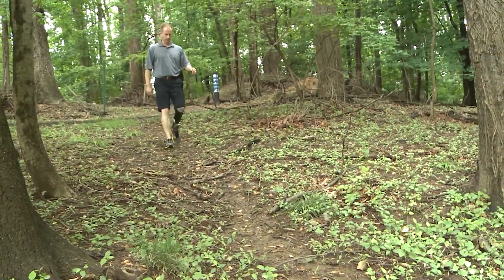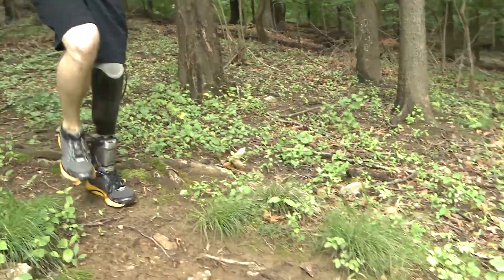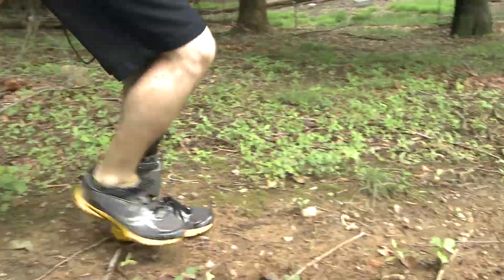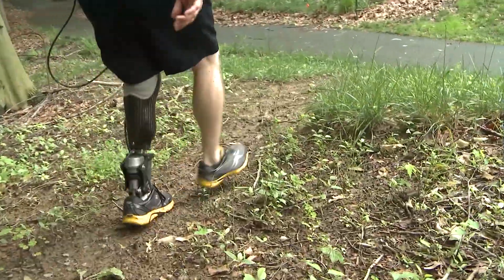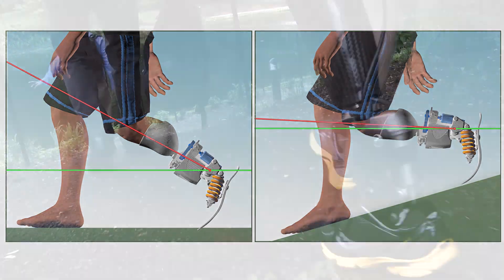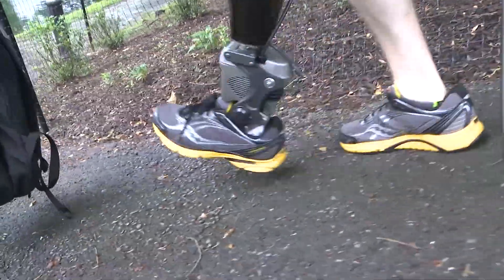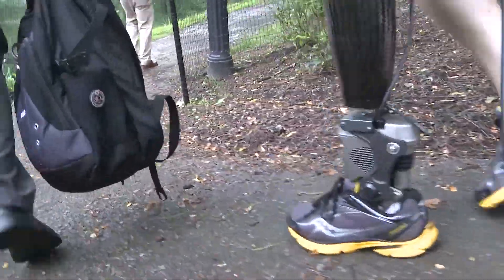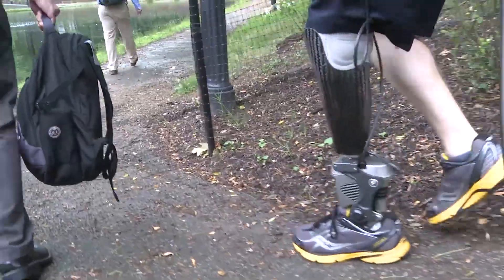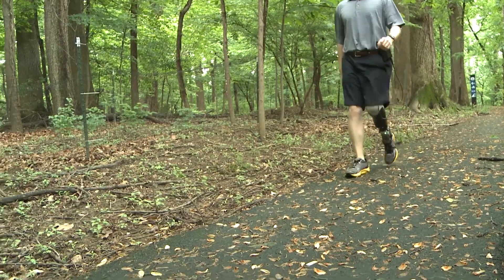It works on declines in the same way — it's looking at the motion of the tibia. One of the things we are working on is to get the push-off reduced when going down an incline, because the motion of the tibia is much greater, so it wants to push a little bit harder. We've been working on activity recognition algorithms so we know when we're going down an incline and can slow that down. Right now it's manageable — you walk a bit slower. Same with stairs. But we want to optimize it.